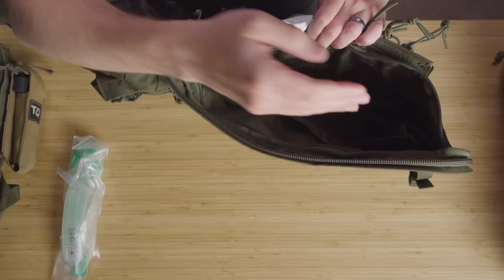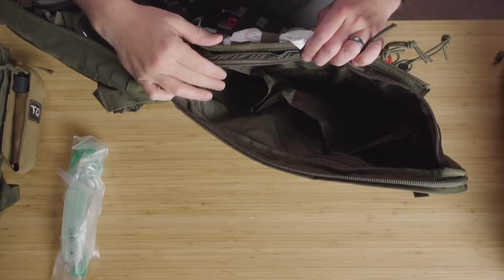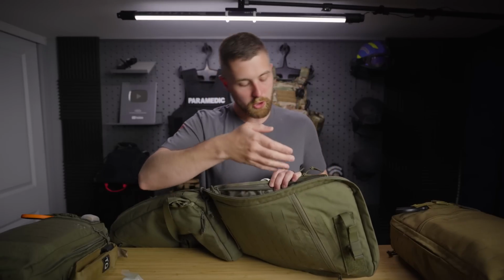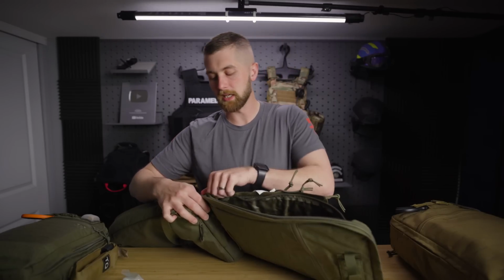So I'd say splints would be a really common thing to put back here. You could put potentially some diagnostic equipment, your junctional tourniquet. I have my meds in that one. So there's a lot of room back here, or you could just put a large burn dressing or something. It's going to fit a wide range of things, but not customizable. This is kind of what you see is what you get.